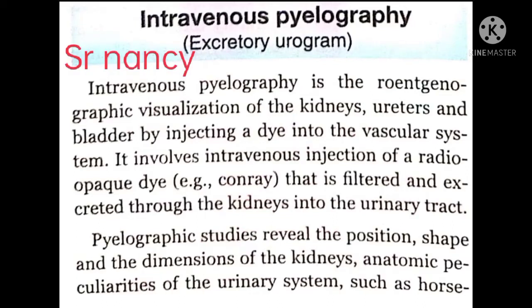Intravenous pyelography, excretory urogram. Intravenous pyelography is the roentgenographic visualization of the kidneys, ureters, and bladder by injecting a dye into the vascular system. It involves intravenous injection of a radio-opaque dye, for example Conray, that is filtered and excreted through the kidneys into the urinary tract.